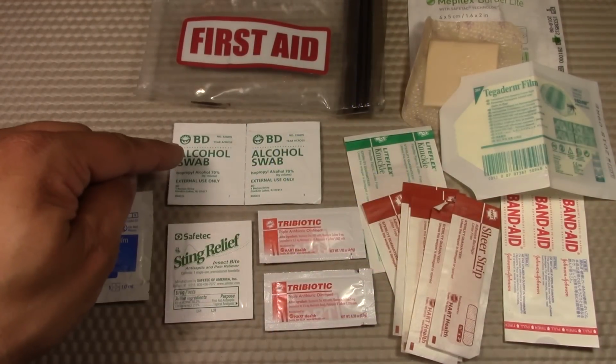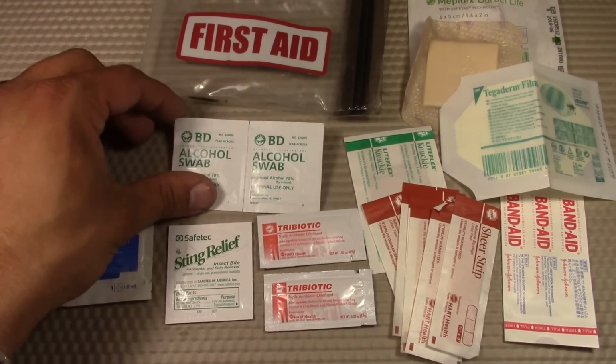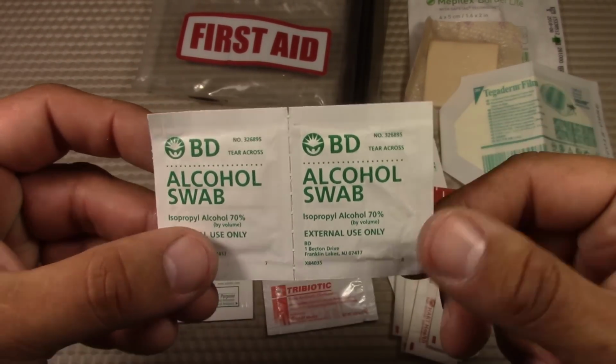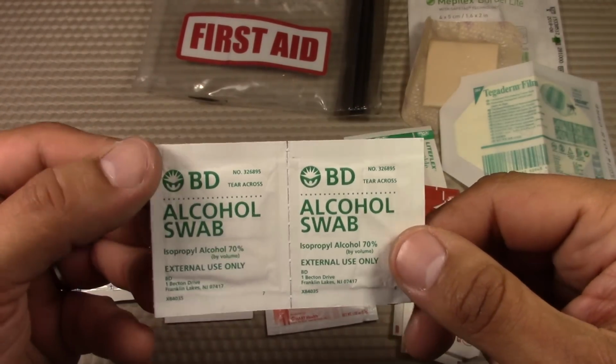Let's breeze through these next few items. So I have some alcohol swabs, some sting relief, and some triple antibiotic ointment. I've been liking using the BD brand of the alcohol swabs. I find that they're a little thicker, they have a lot more moisture in them, and they just work well. So I get these by the box.